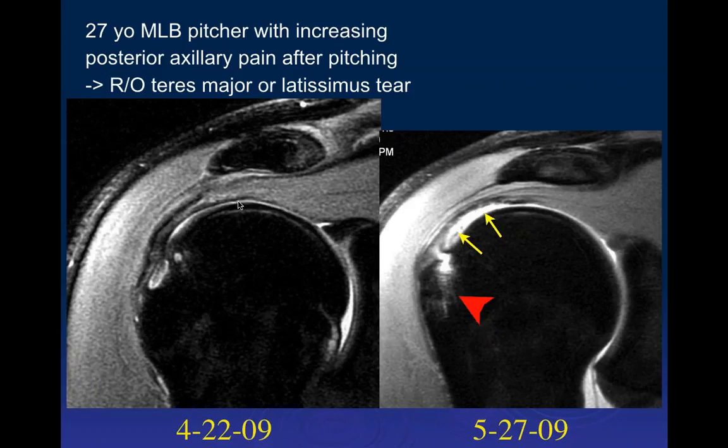Yeah, well, here, I don't know what the call was by the radiologist, but from my experience, with minimal knowledge about MRI, I think that's a tear. I would have known avulsion. Yeah, well, I certainly think there's a bone injury here. The tendon itself, at least the inferior surface, looks intact here. It looks like most of the pathology is actually out here at the tendon interface. At the footprint, yeah, at the footprint, right.